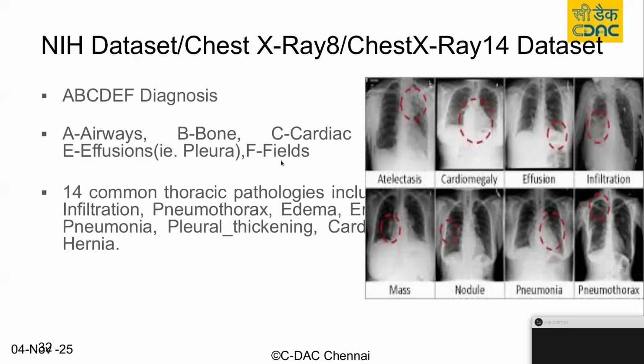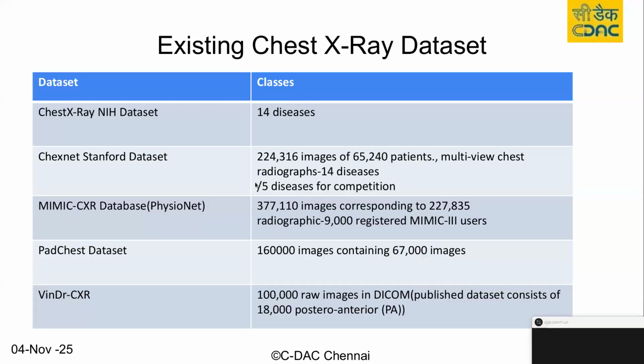So this was a method for abnormalities in each of these body regions that doctors were looking at. But machines we have to train with the images which are abnormal. So later the neural networks become brilliant enough to understand these diseases. So that's the methodology we follow in machine learning algorithms.